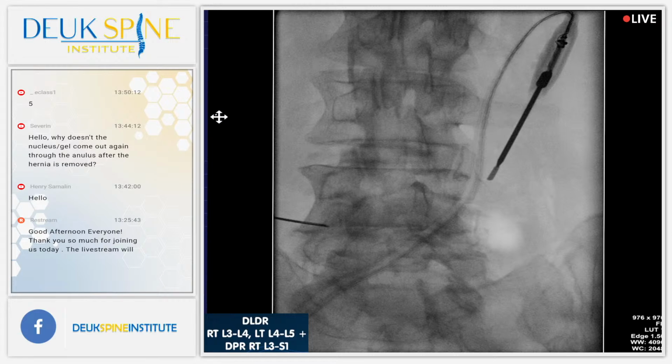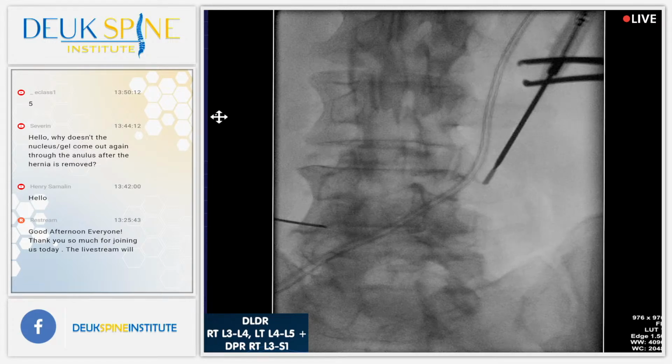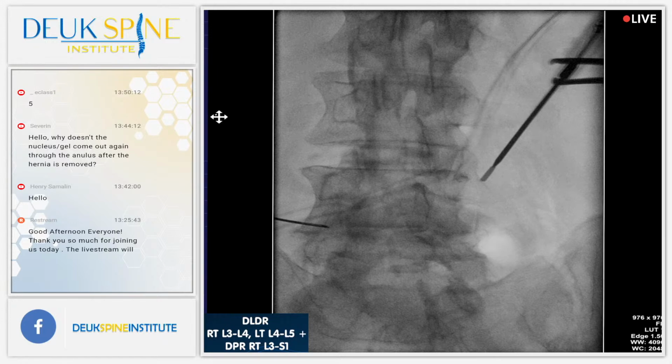I'm right on that bone. Like I said, very abnormal transverse process for him. Very abnormal anatomy. Shot, I want to make sure. Yep, it's perfect. So I'm moving it around, I'm hopping. Dr. Patel and I talked about this today. It's a hop and a slide. And we call it the Deuk spine hop and slide. Shot? No, see where the tip is, guys and gals? That is literally the perfect spot. That's where you want to be.